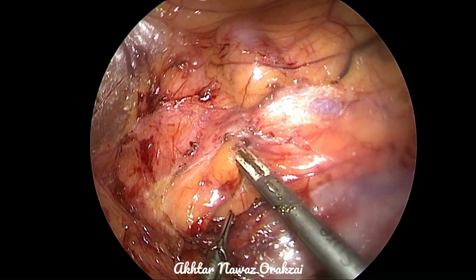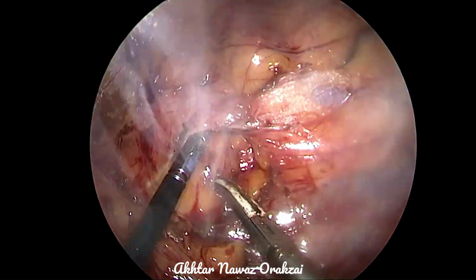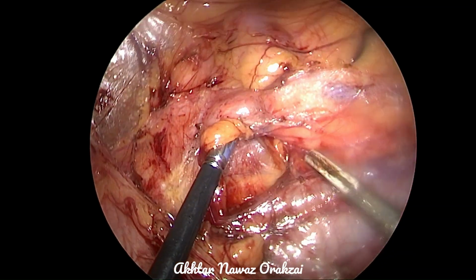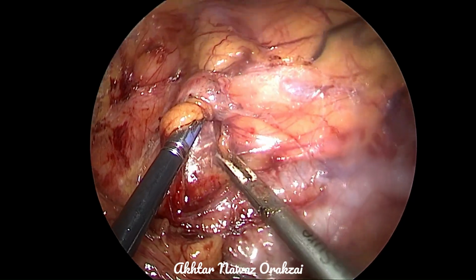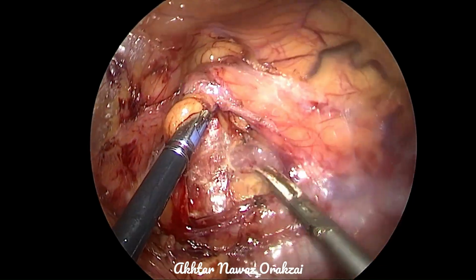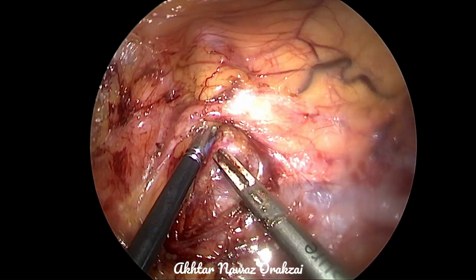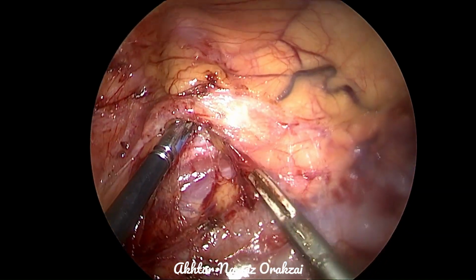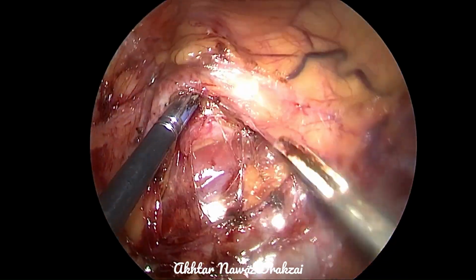We have mobilized the colon. Now we are mobilizing the lower pole of the kidney. I have included this step just because I wanted to show two things. Number one, we have to look for the ureter and try to save it, not to injure it. Here you can see that the ureter is having a nice peristalsis.